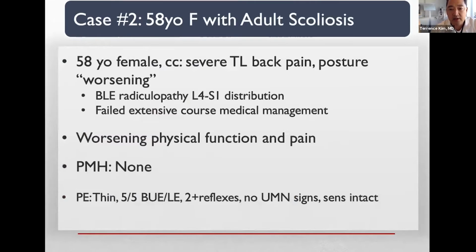So as we take this to our second case, one would think things would be different for a bigger adult scoliosis or deformity case. But my message is, if the workflow is good and compact and everyone knows their plan, then it's basically a very standardized process. And that's what you want to do in order to improve your overall efficiency.